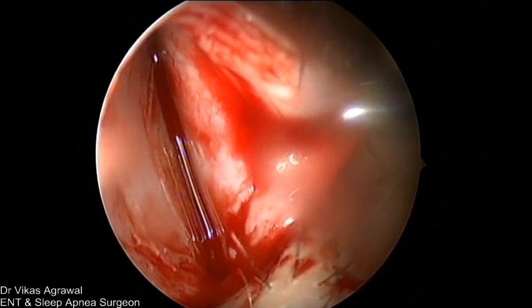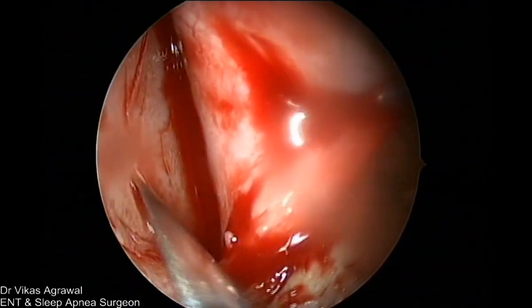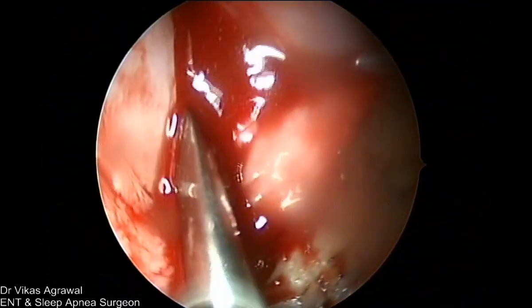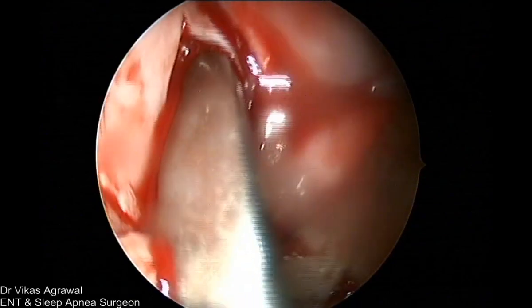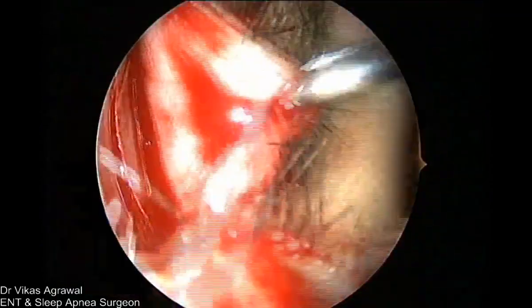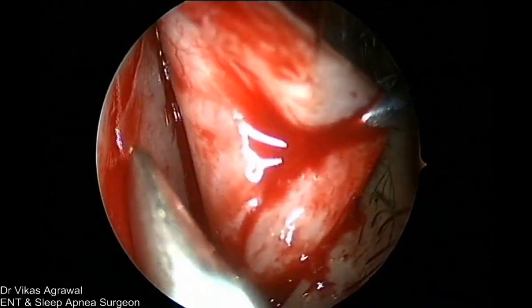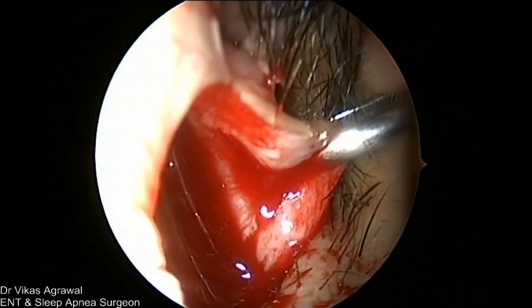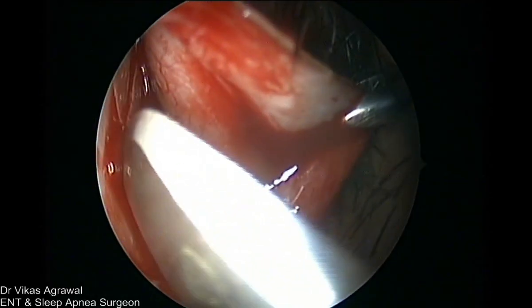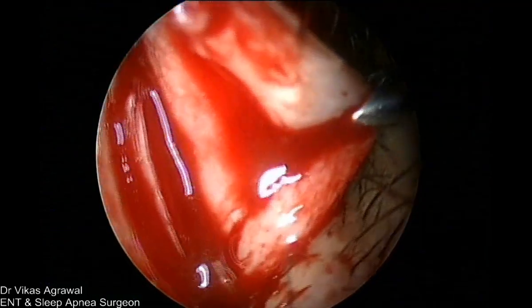And immediately post-operatively, we have something like a CPAP, I will show you, a disposable CPAP system which is very cheap and very easy for a patient to manage, and which can increase the oxygenation of the patient in the post-operative period. So this is a whole combination of teamwork as well as understanding the whole paradigm of OSA patients.